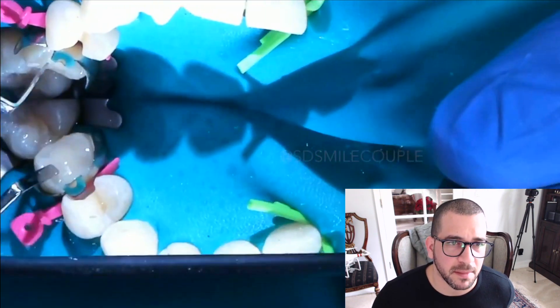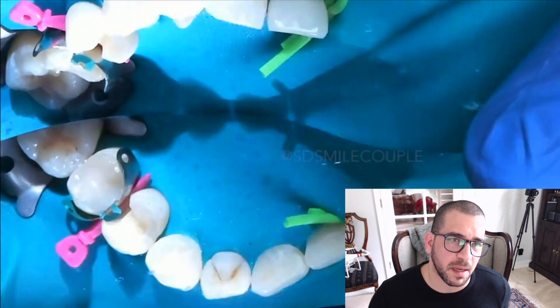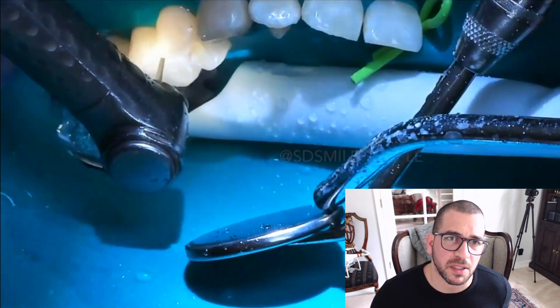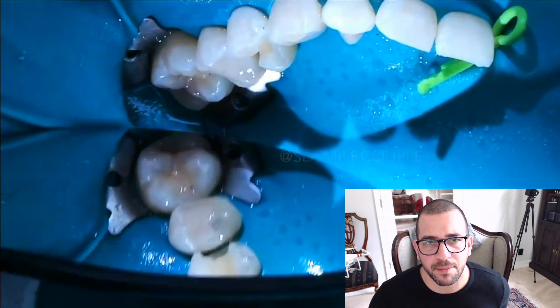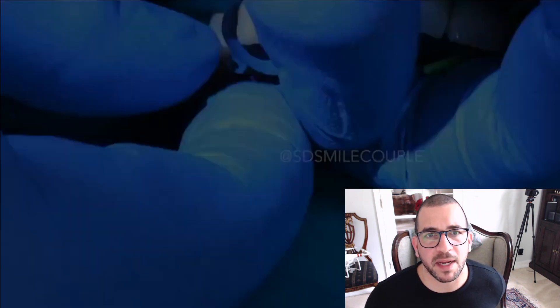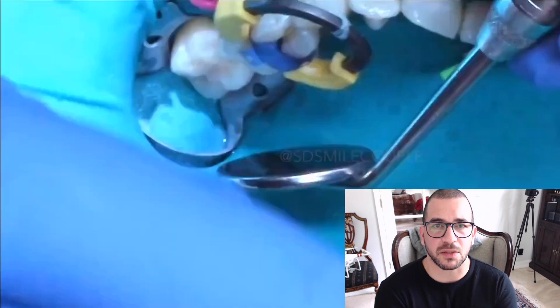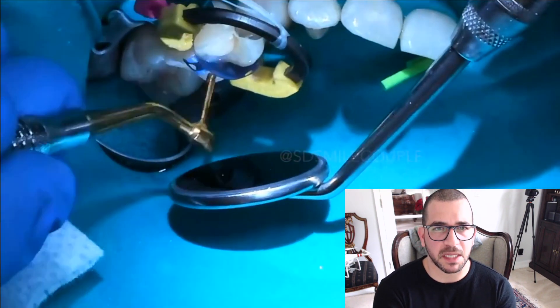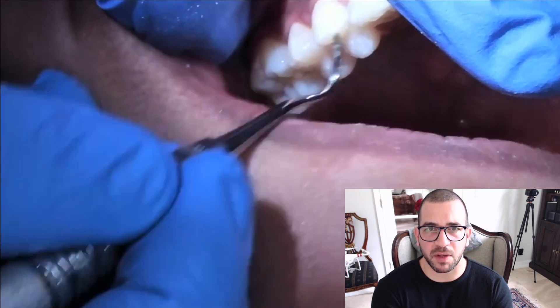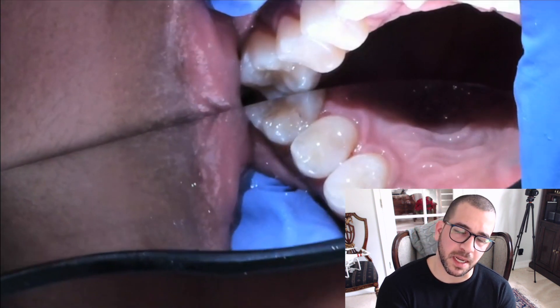Now as you can imagine there's going to be excess composite. So we're taking the flat-ended instrument, removing the excess composite, curing everything together, and then it looks like we're taking the entire system off. I do like to fine-tune and polish with a fine diamond after I do that. As you can see here the contours are nice, but I want it a little bit more rounded so I'm taking a red-shaped disc and just rounding it out. Now here we have the ring for the second class 2 restoration. At the end we make sure we scale everything, remove any excess bonding, and we have a really nice contact.